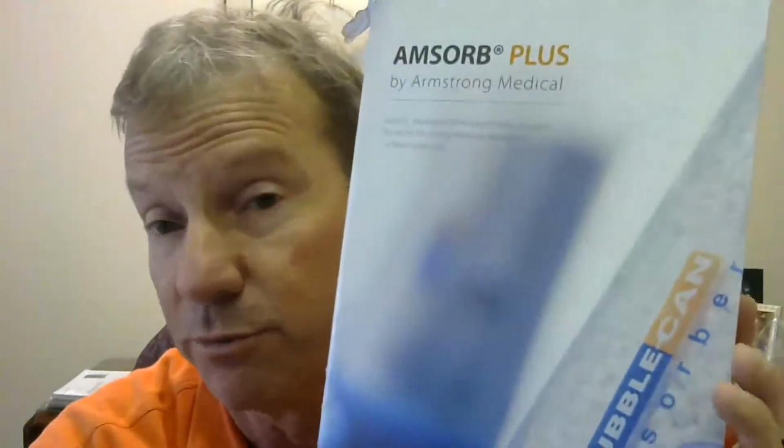You'll come across some accounts that might be changing it based on inspired CO2, and they're using an absorbent such as Medisorb, and that can be dangerous, so we need to help them understand the dangers of using a sodium hydroxide based absorbent and at the same time trying to push that absorbent beyond its normal usage, because as a color change occurs, that portion that's color changed can produce those toxins. So if they push it to a point of inspired CO2, it's going to be very exhausted, or desiccated, if you will, and the possibility of producing those toxins is significant.